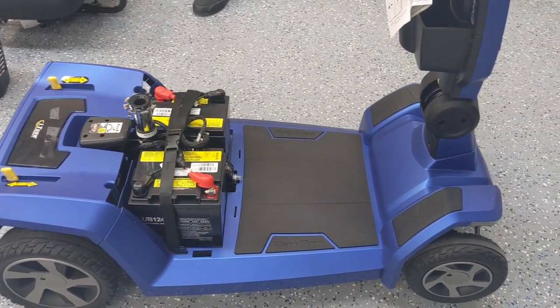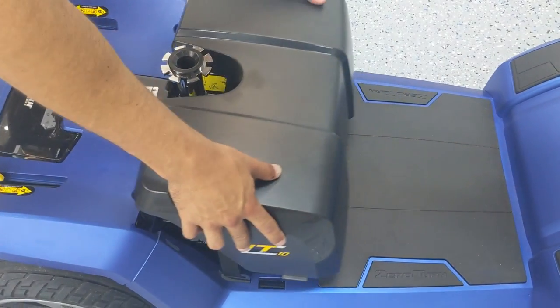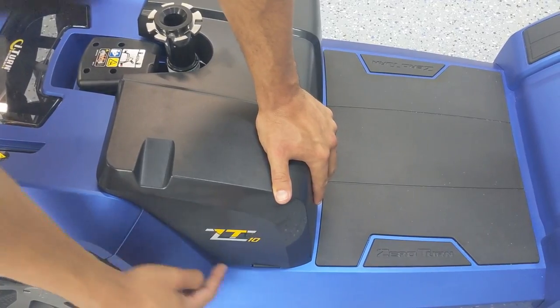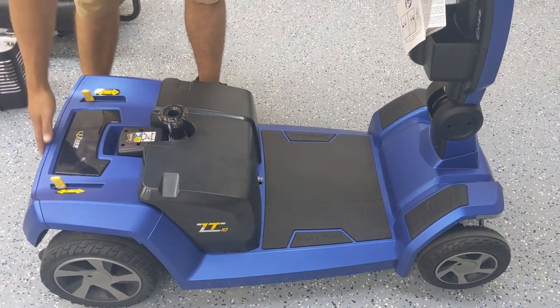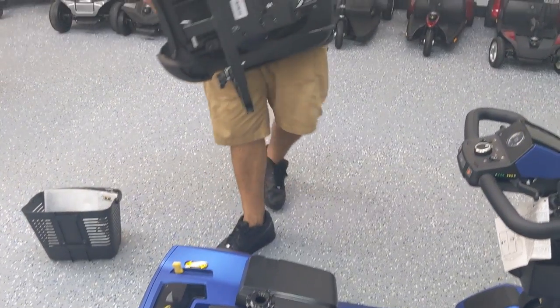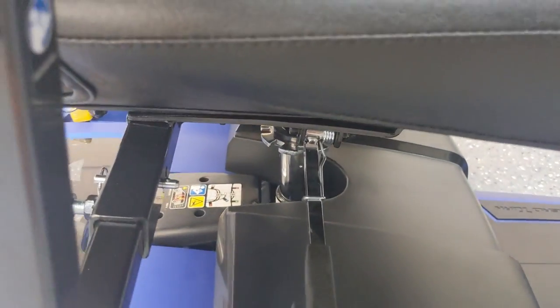Now that the batteries are back in place and everything is connected, the shroud cover just slides right on. As long as there are no harnesses in the way, it should fall right into place and pop in on both sides. Now that the battery shroud cover is on, we can pick up the seat. The male end of the seat plug pops right into the female receiving end — there's no secret to it; it just slides in and drops into place, and now it's locked.